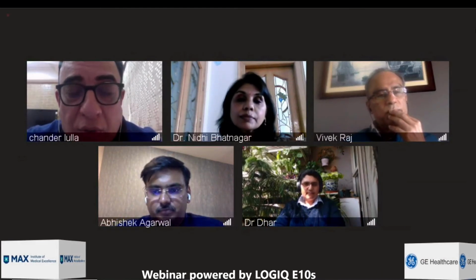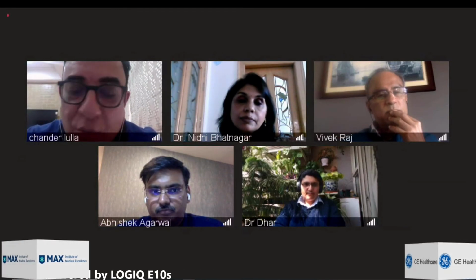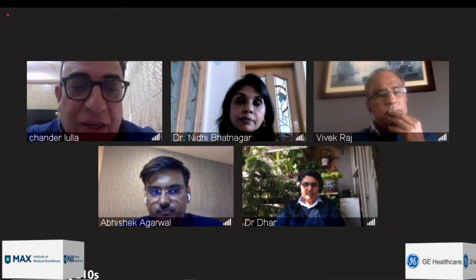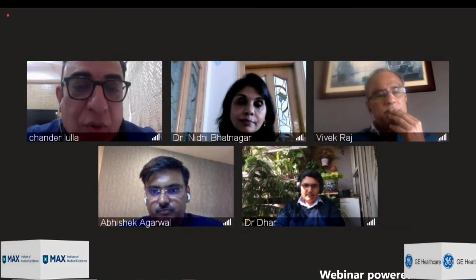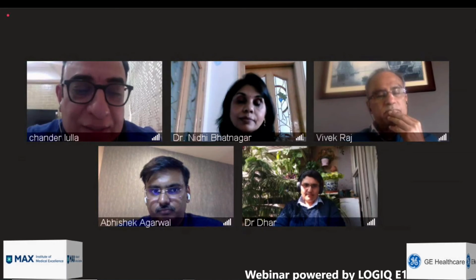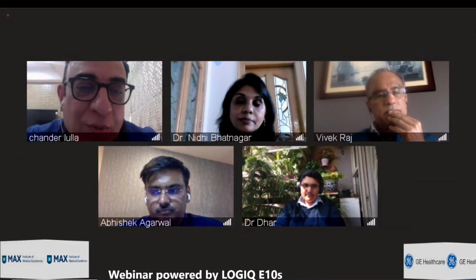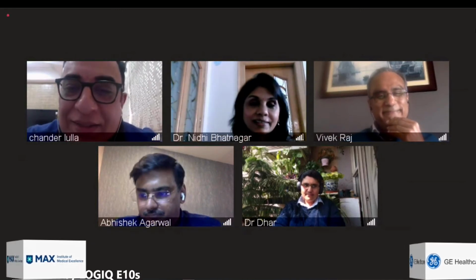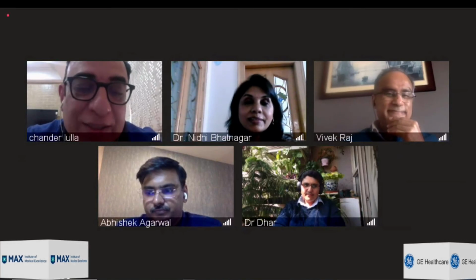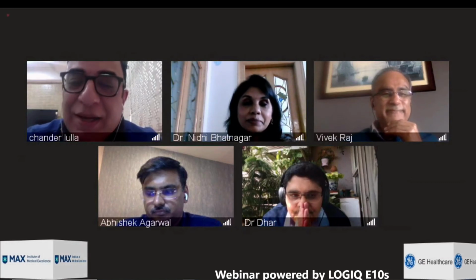And I also want to add a point that in the risk assessment, although I do appreciate all the clinicians on the panel are saying I don't need elastography, I think in time to come we'll need all objective criteria. It's that one-off case which can really put you off guard and then you know what went wrong. So as a summary statement for me, please put all the tools available to use. Don't rely entirely on clinical judgment, although you are extremely good clinicians. Please be careful.